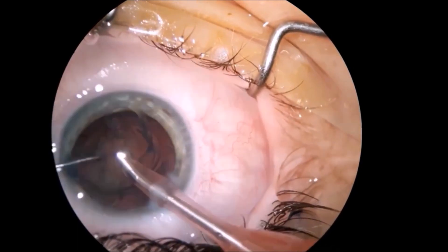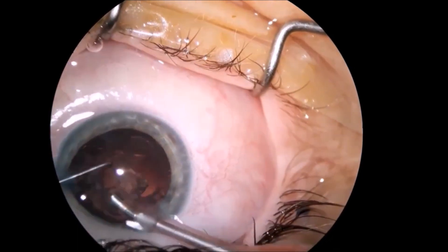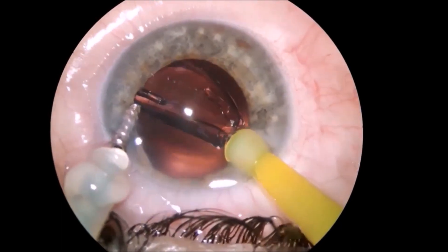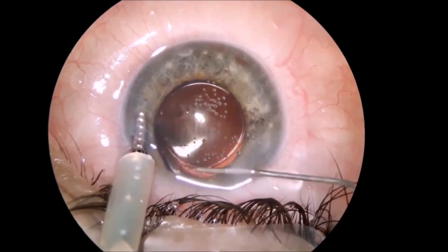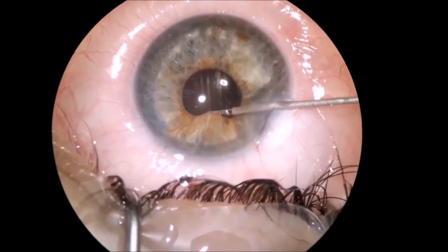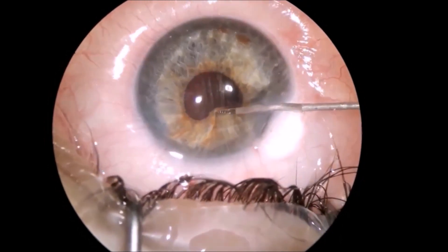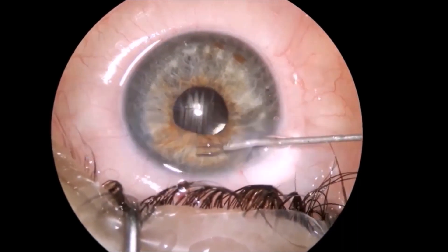Having a clear bag at the end of the phaco surgery in these glaucoma patients is very important in order to keep the inflammation down, and here is the synechiolysis that I do at the end of the surgery.